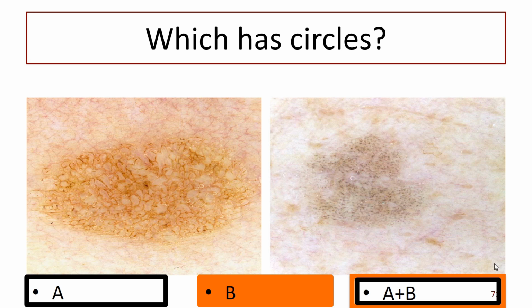White clods? Actually, we call them skin-coloured. They're not very white. They're the colour of the surrounding skin. That's an important differentiation because white means cancer, often, or fibrosis in the dermis. And here, we're not actually seeing white, we're just seeing the normal skin colour, which might be white skin. You will become familiar with the difference as we go along. So this is skin-coloured clods with brown circles around them. Now, Anna, how can you describe this?